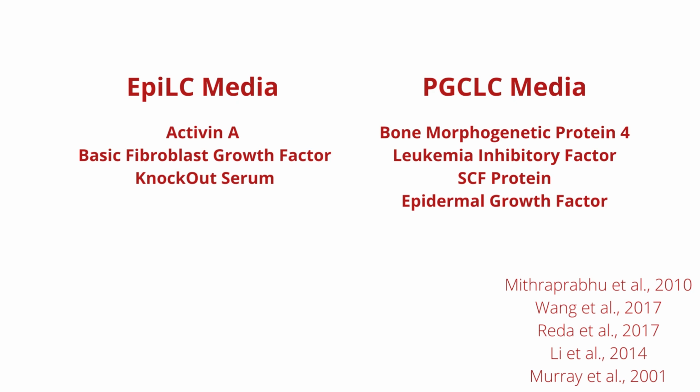Spheres of mouse embryonic stem cells were then submerged in Epi-LC media for 3 days, followed by PGCLC media in order to encourage differentiation. This slide lists the active compounds for both the Epi-LC and PGCLC media.